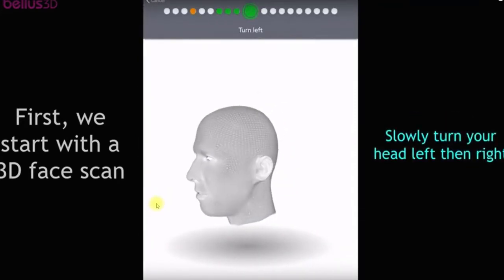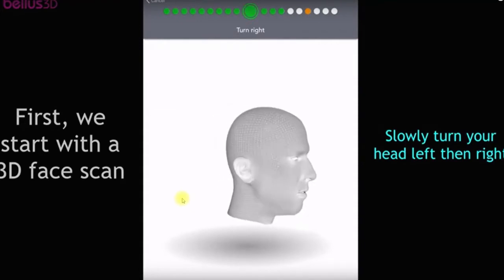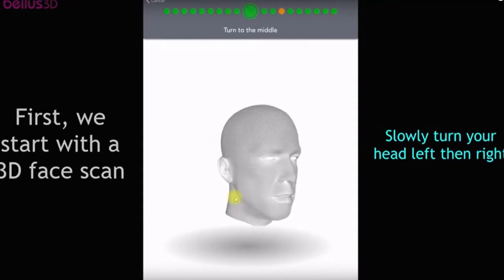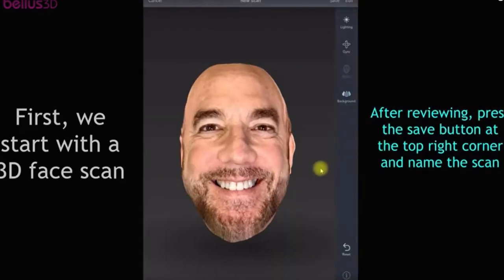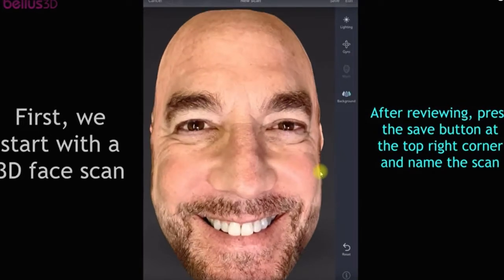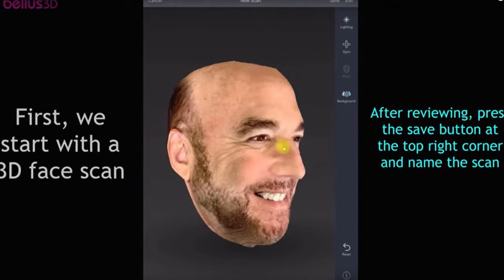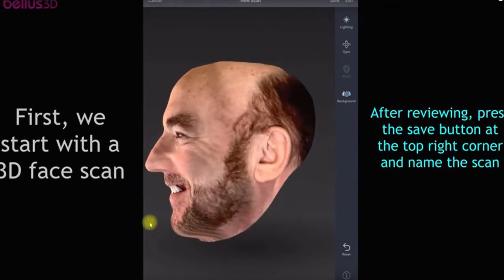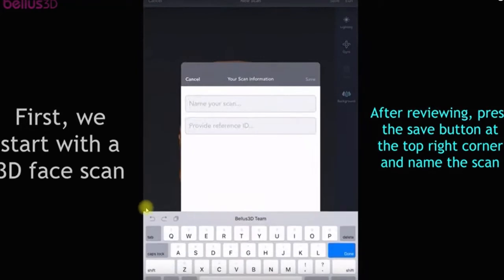So you really only need two scans. The big old cheesy one, and when you do the retracted one, make sure the retractors are flush with the face. You only have to get the top arch. After you get the scan, save it and name it the patient's name.